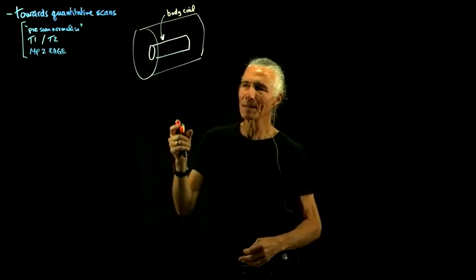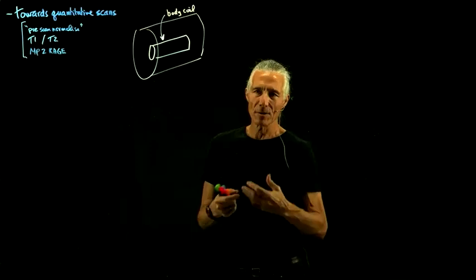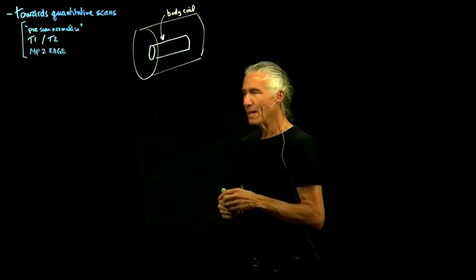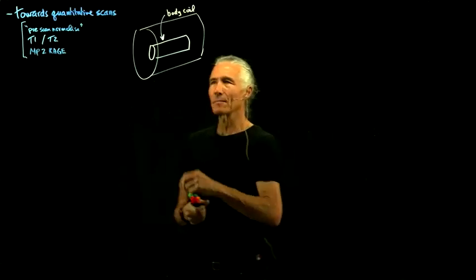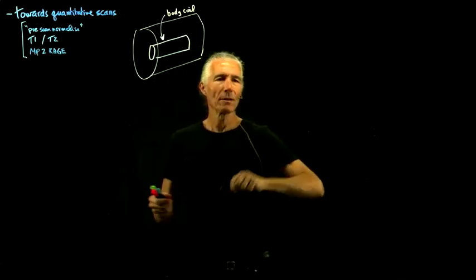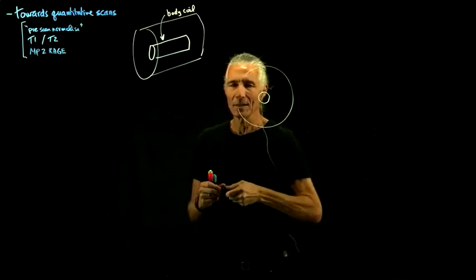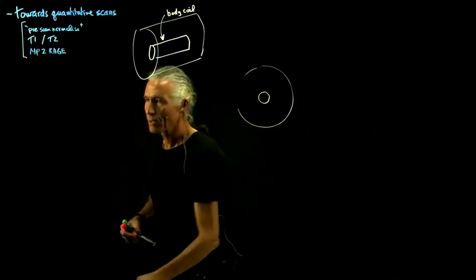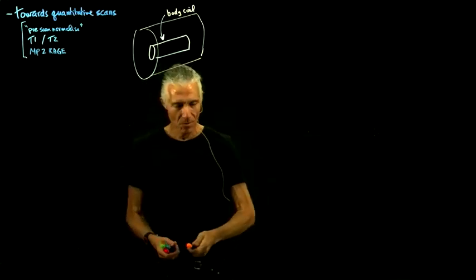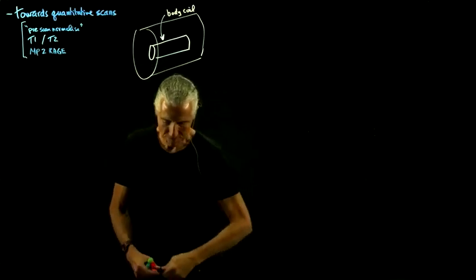So if you look at the image that you get from a body coil, you can transmit from the body coil and also receive from it. You see the image looks a lot noisier, but it's much more uniform because it's much further from the thing that you're recording. The body coil is like a big coil like that, and you've got this little head inside of it, so it's not going to have this coil fall-off problem. And so you just record a quick and dirty image from the body coil.